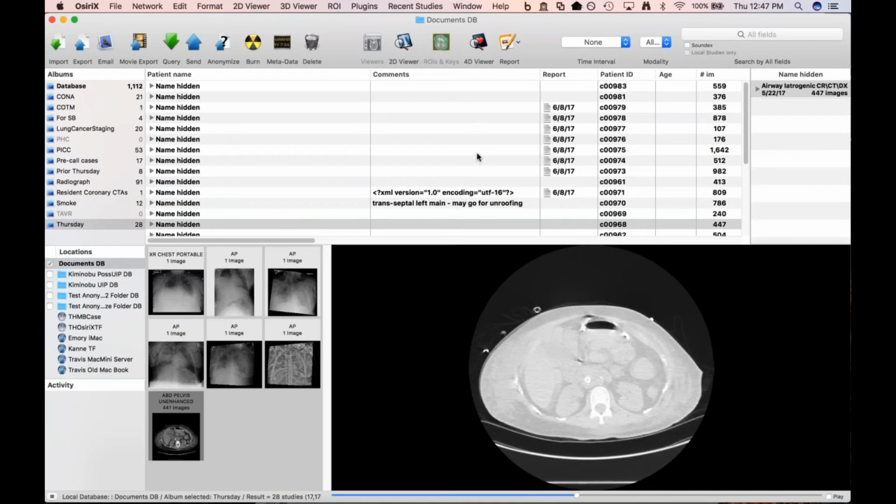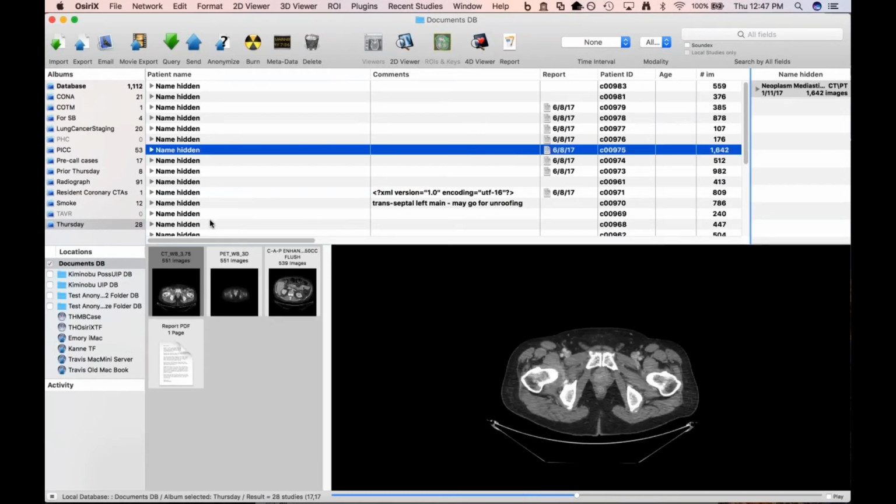I'll bet you it was from the placement itself, from the sharp tip of that endotracheal tube going down. Maybe. Yeah, I found one case series of 3 cases that describe different mechanisms, both of which were included.